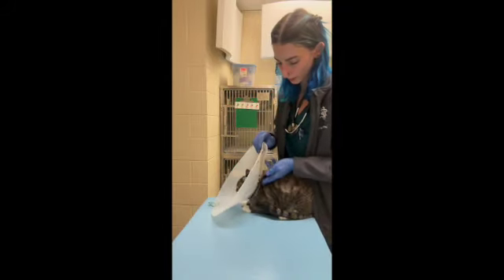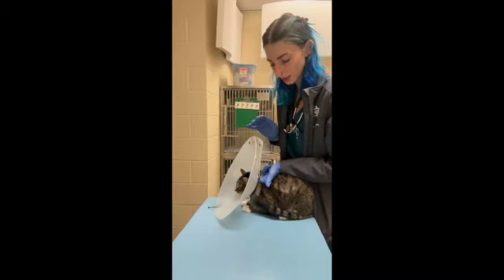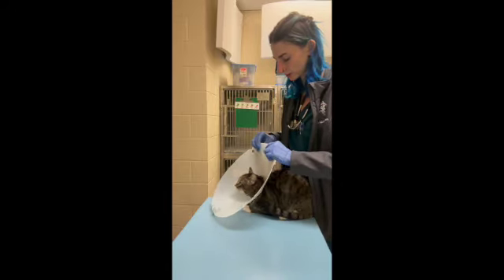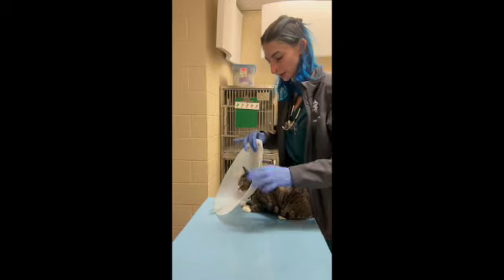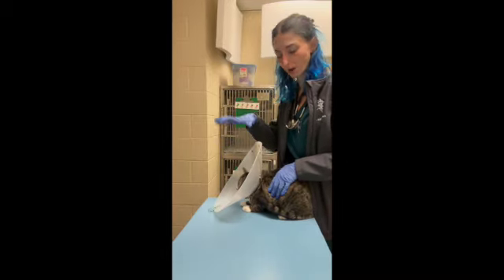I have my two bottom ones buckled. Before I do the top, I want to make sure I'm able to slip two fingers underneath comfortably, and I am able to do that. Now I'm going to secure the top portions. To make sure it's correct, I like to do a nice little tug over the ears to make sure it's not going to come sliding off.